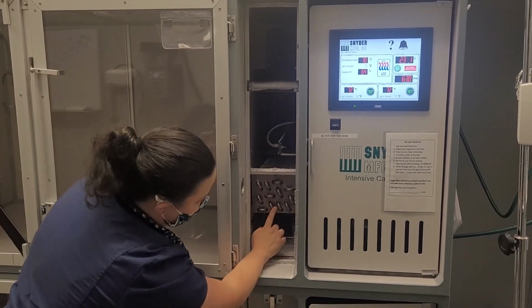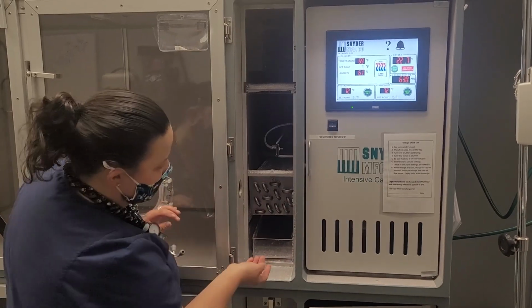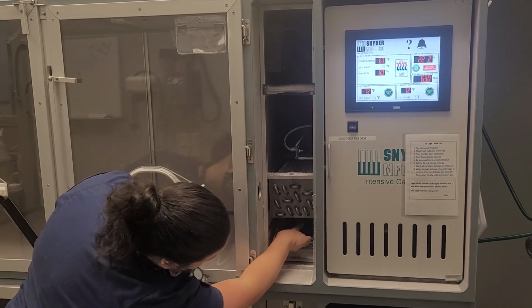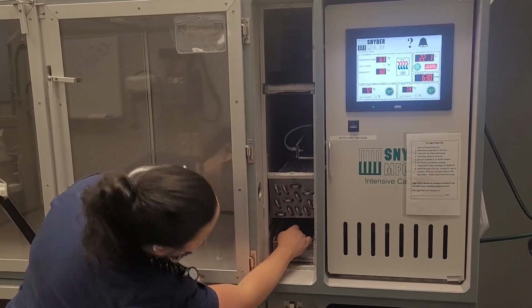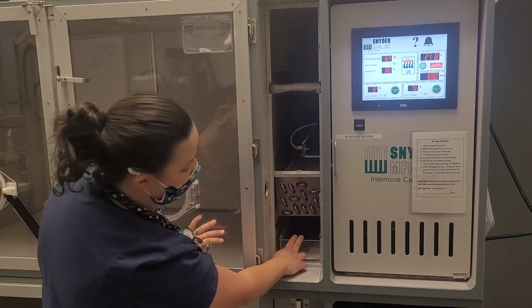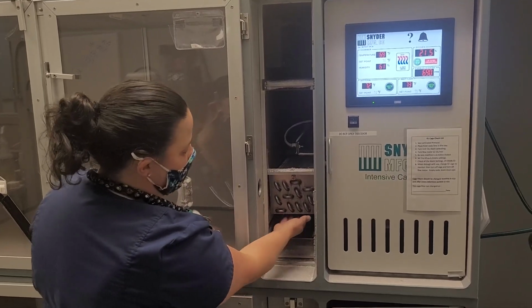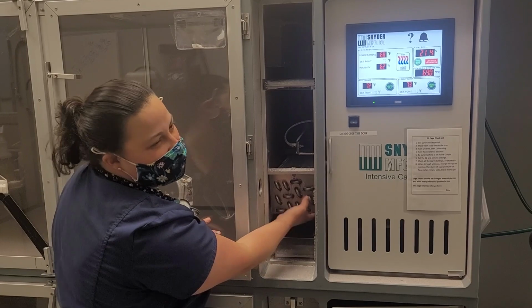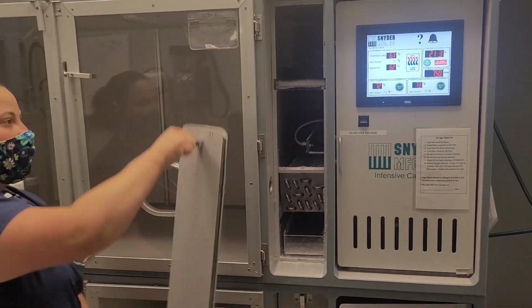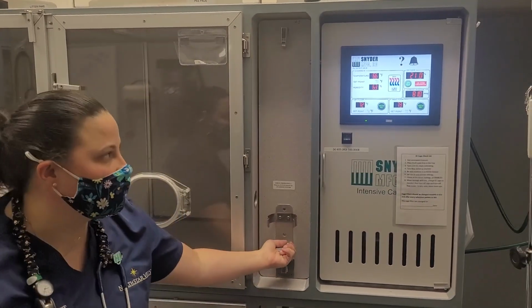This is your compressor, so this is what gets cool to keep everything inside the cage cool. You're going to want to take your hand or a towel. Just be careful because there is a temperature meter in here. But you're basically going to want to bang out the condenser all the way to the back to have the water drip into your tray. You can do that a couple of times. Make sure you try to use a towel to absorb it. And then your humidity should fix itself. And that way you don't have to keep your cage on dehumidify because it'll freeze up your compressor.